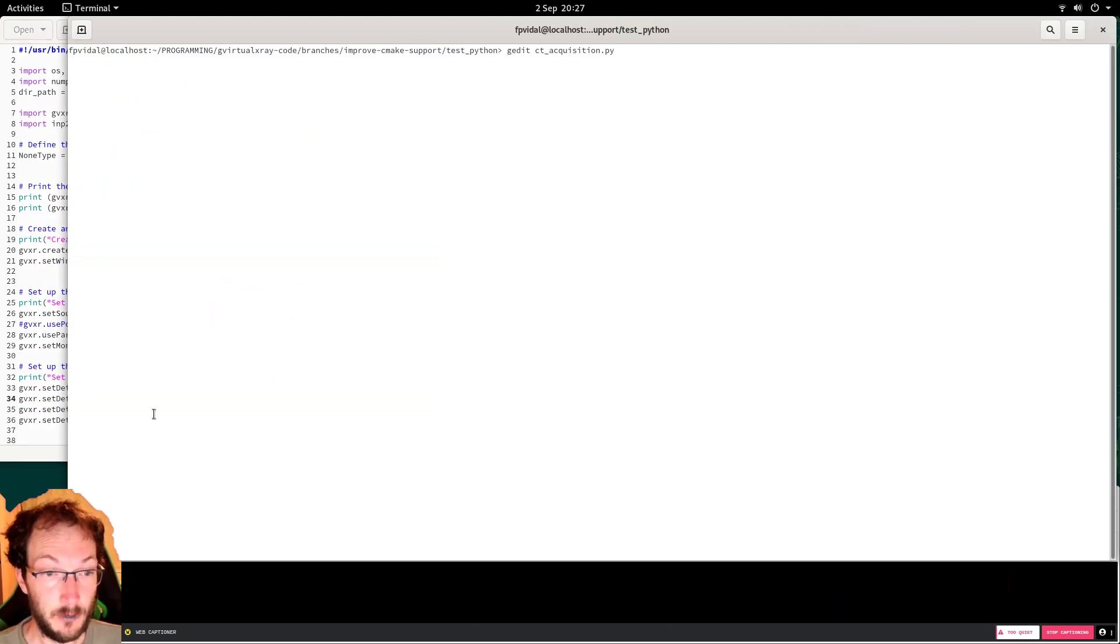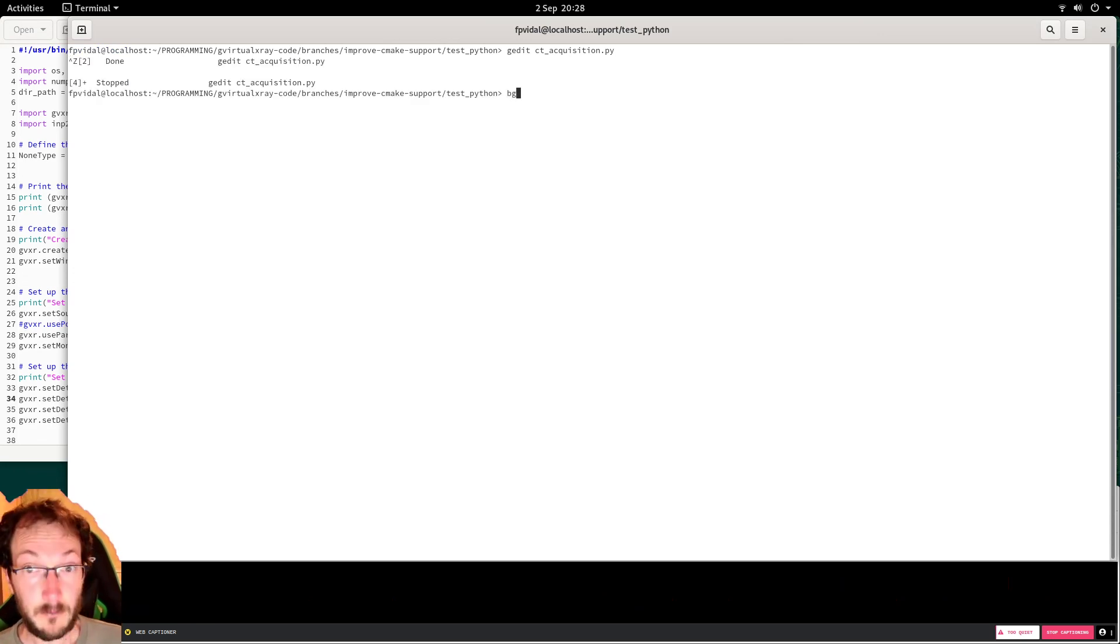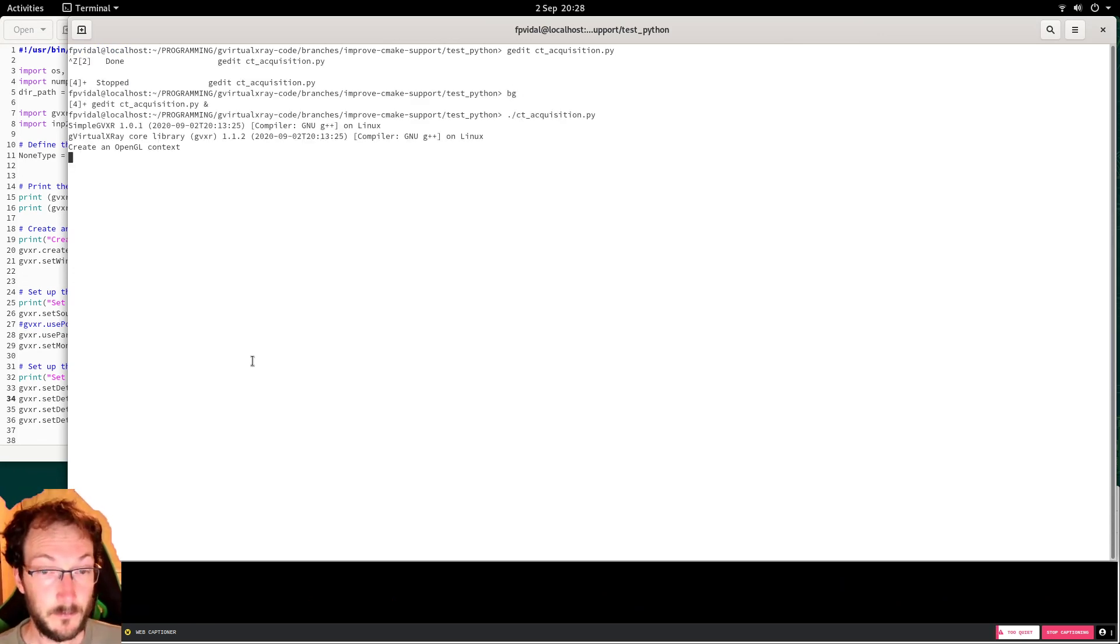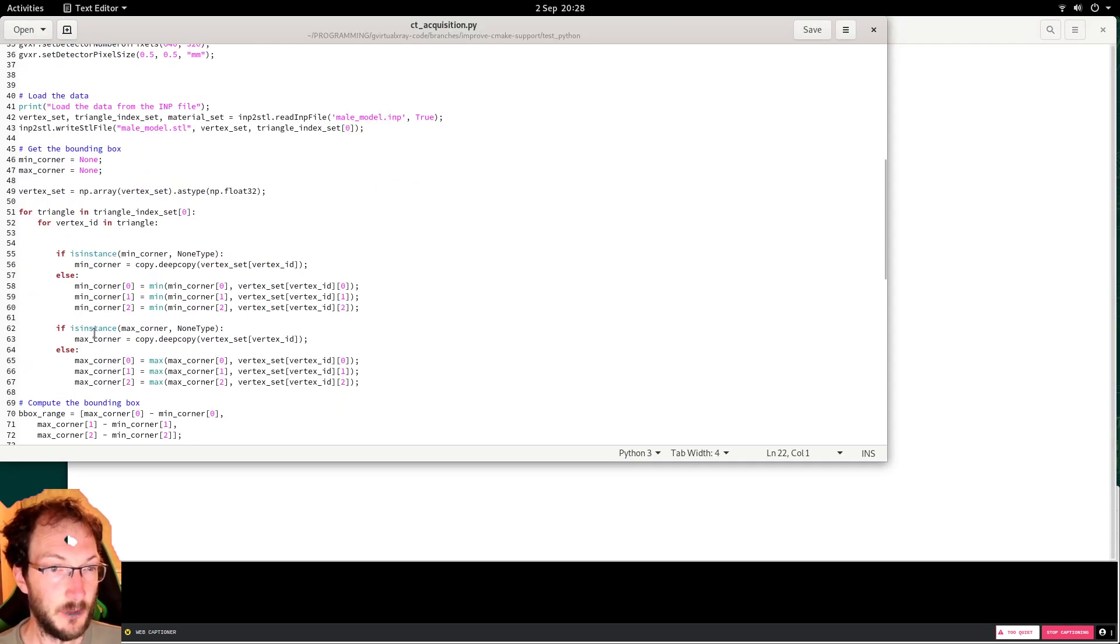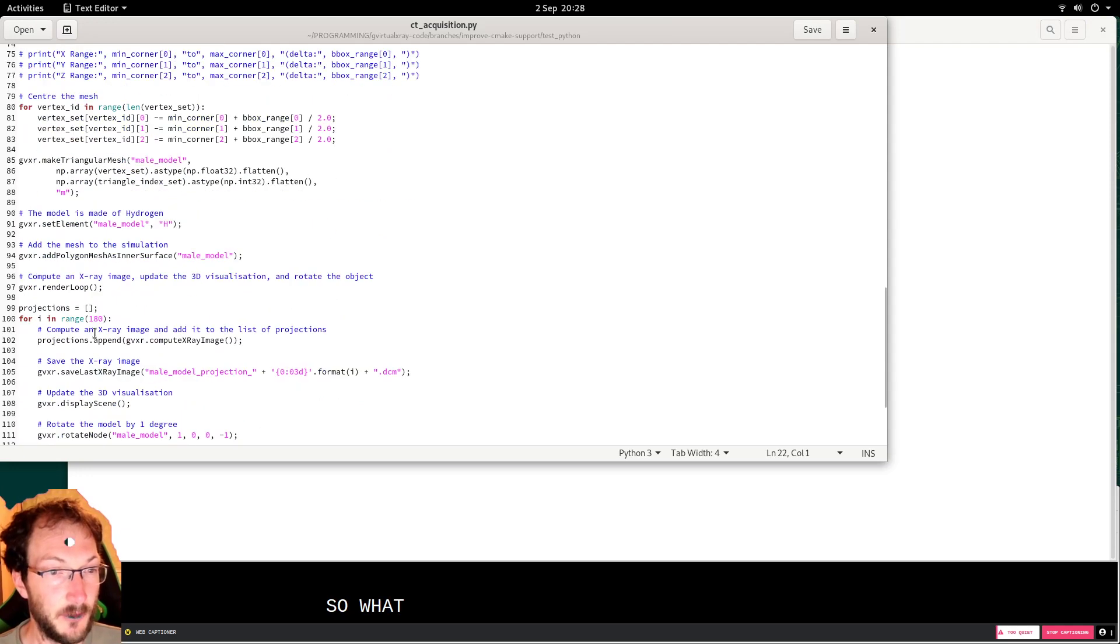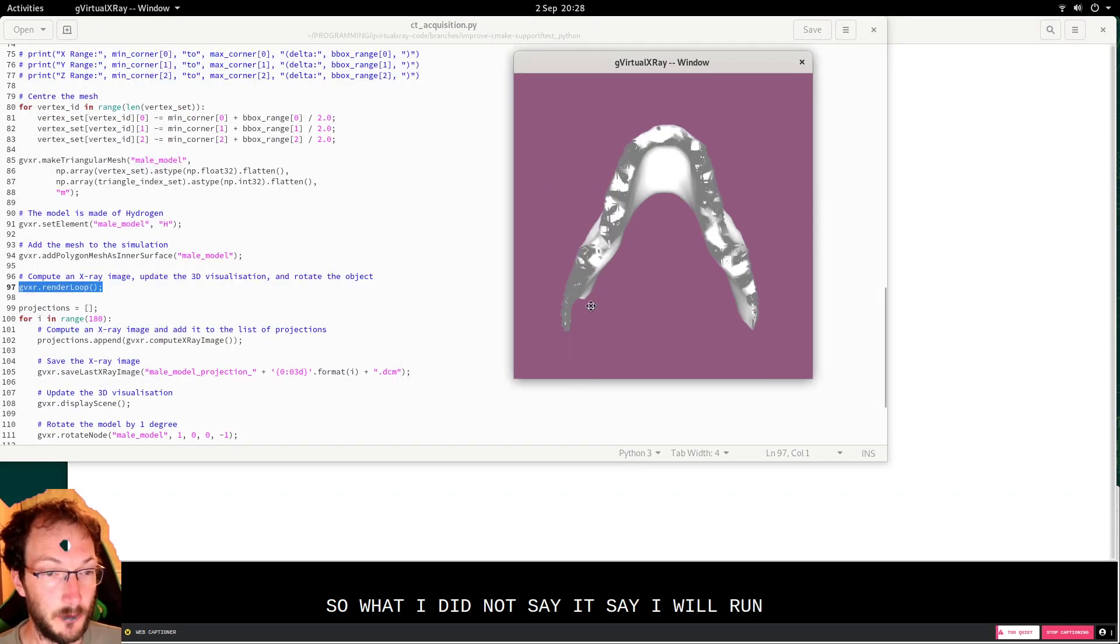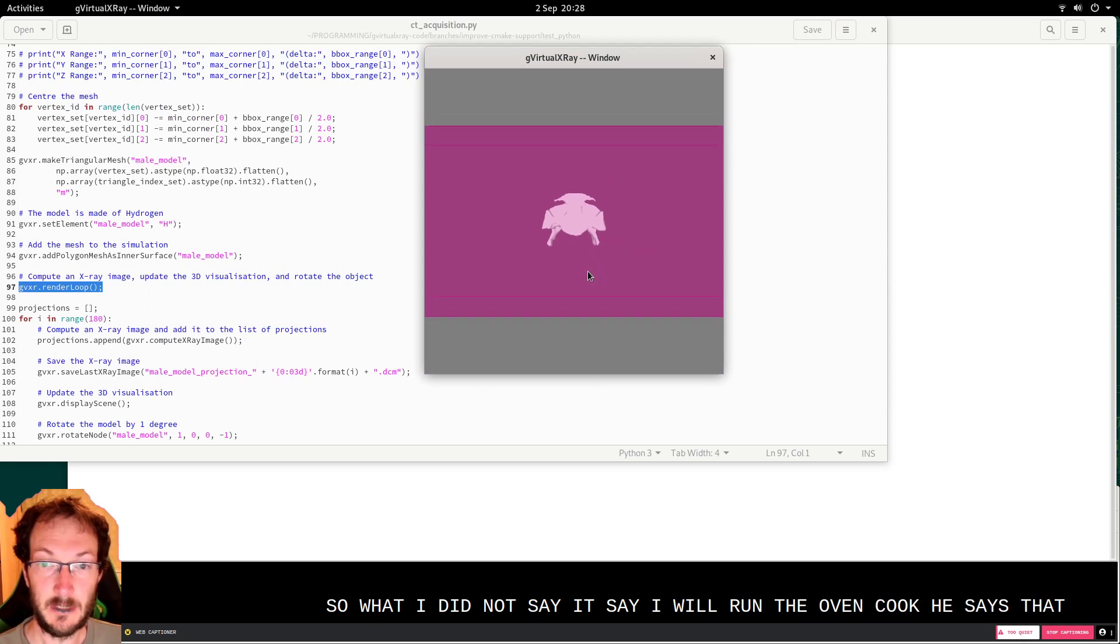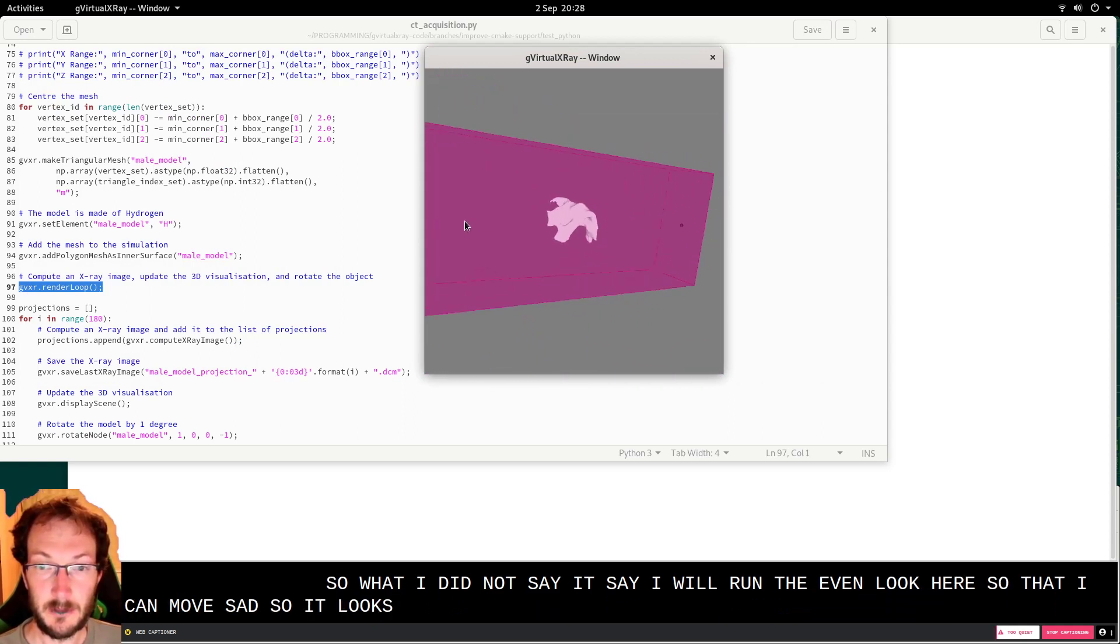So if you run that... simulating the data. So what I did not say is that I will run the event loop here so that I can move that, so it looks nice.